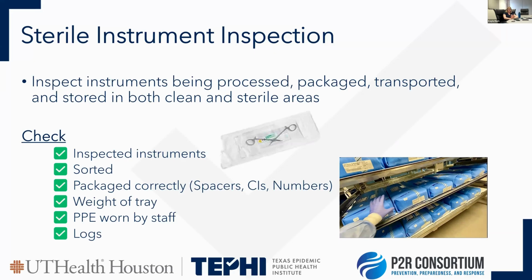Again, when we have these now sterile devices that have been ran through the device, what type of PPE is the individuals that are taking them out of the sterilizers into where the sterile equipment is going to be stored? What PPE did they put on? New PPE? Was this other PPE that they're wearing? Look at that. Look at their process of changing PPE, and then also transportation.